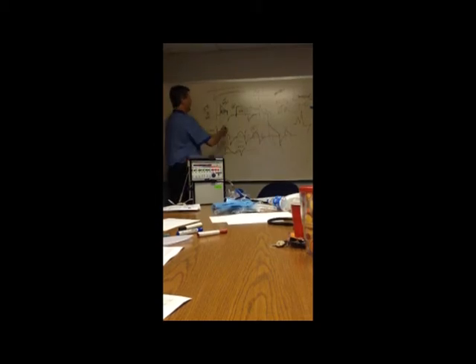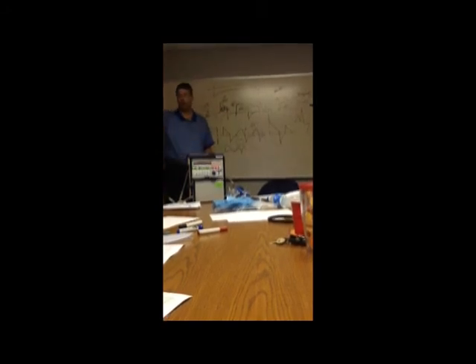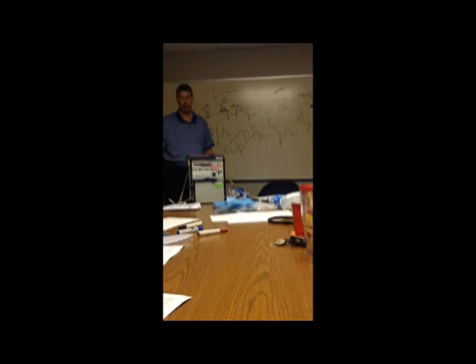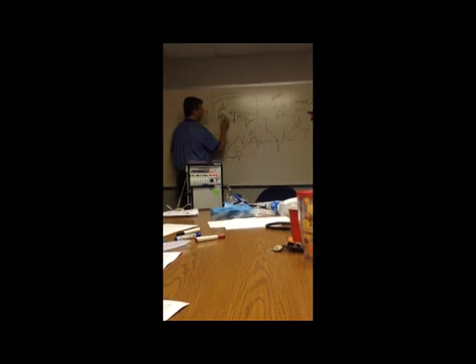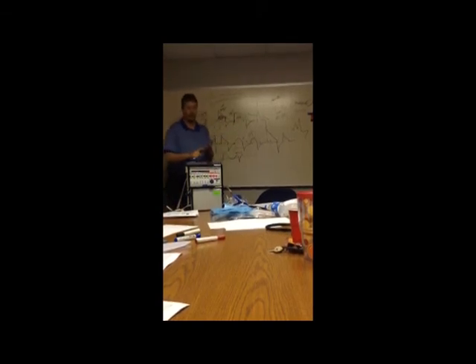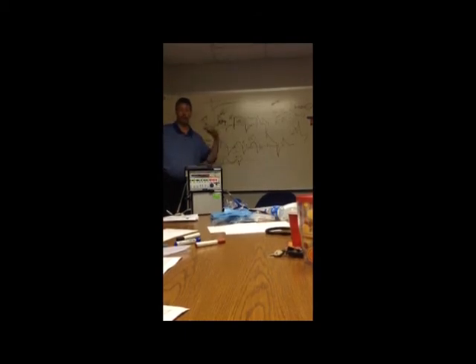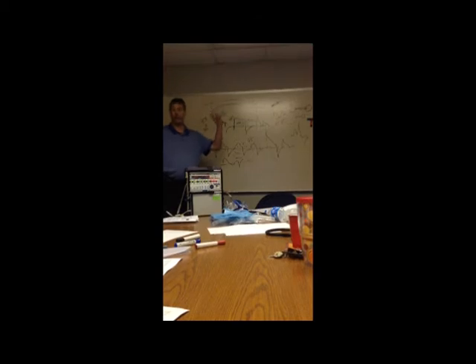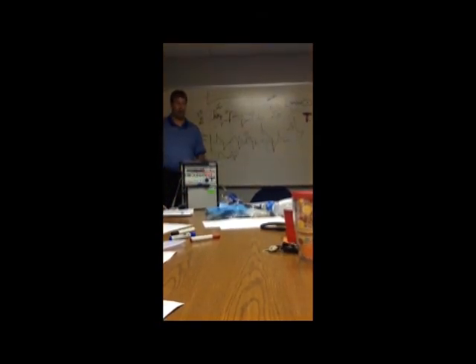But if I had this patient on here and their lungs were stiff and I was getting peak pressures of 35 every breath, 33 one breath, 34 the next, I would consider either giving them a little bit longer for that same amount of air to get in, so it doesn't have to get the pressure so high so quick, or I'd just decrease the tidal volume a little bit if it was on the upper end of what I was comfortable with, okay? In volume ventilation, this is the difference. In volume, you set the volume and time, and the pressure varies depending on how stiff.